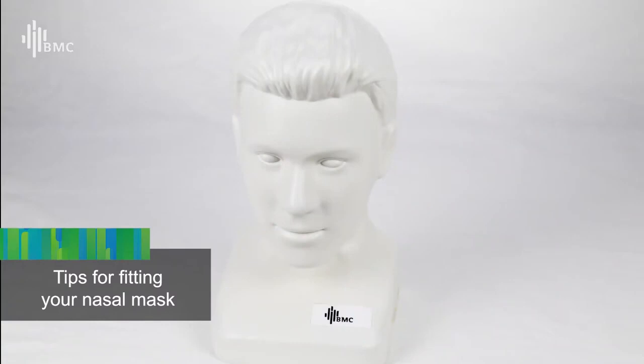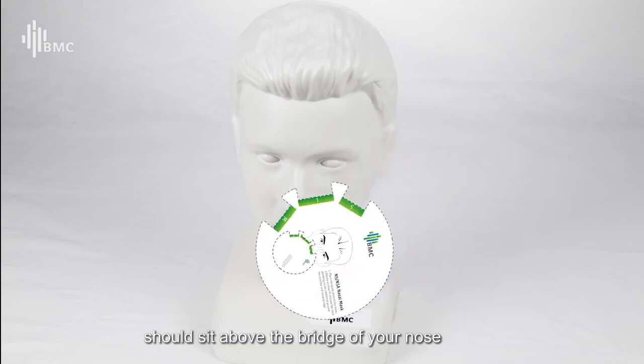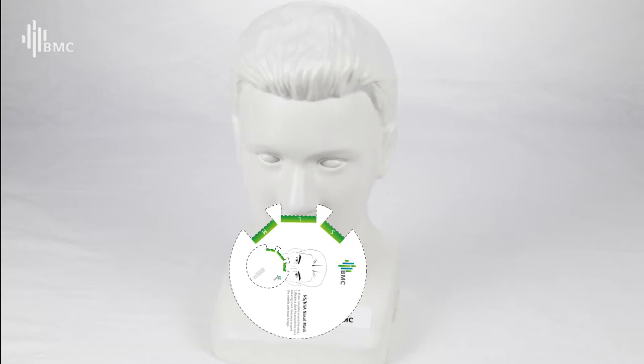Tips for fitting your nasal mask. The top of the nasal mask cushion should sit above the bridge of your nose with the lower edge under your nostrils. Please ensure your breathing isn't obstructed. Please refer to the nasal mask user guide for detailed instructions.